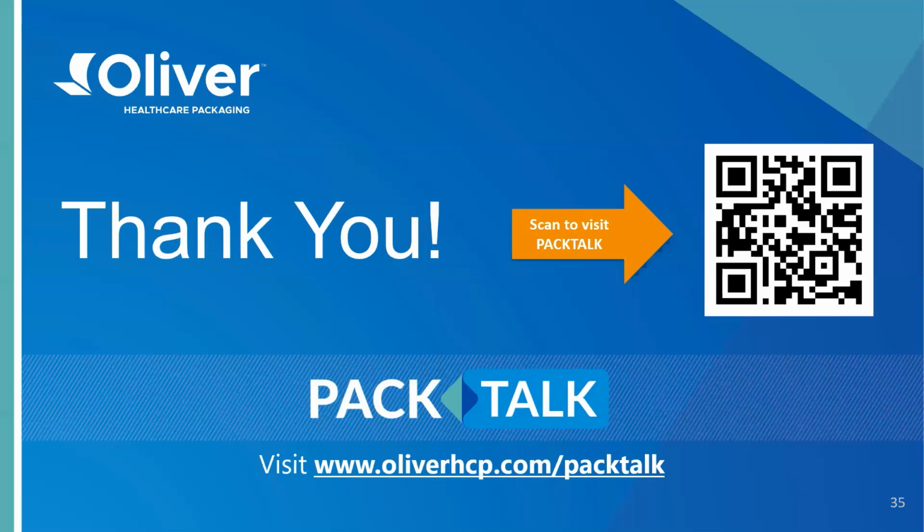Really, the advantages of a corner peel are for optimizing the layout or footprint of a pouch. The interior of the pouch can remain the same size, but the exterior can be reduced if you go from a chevron to a corner peel type of application.